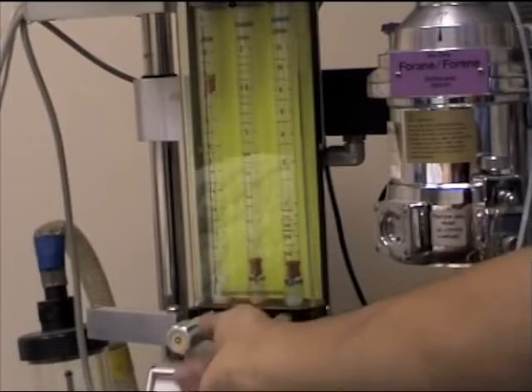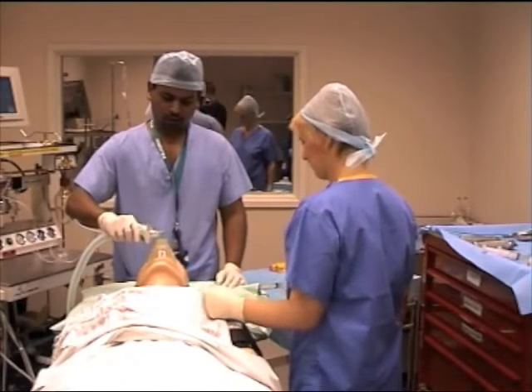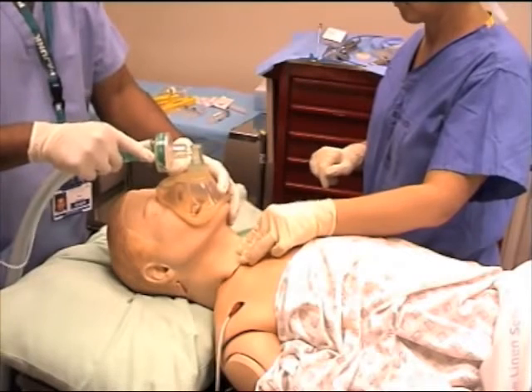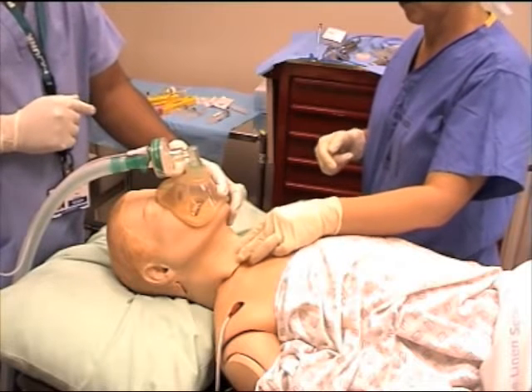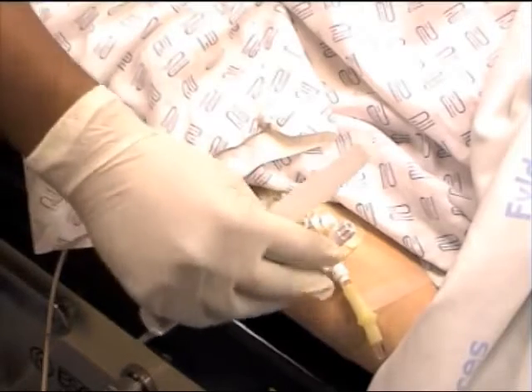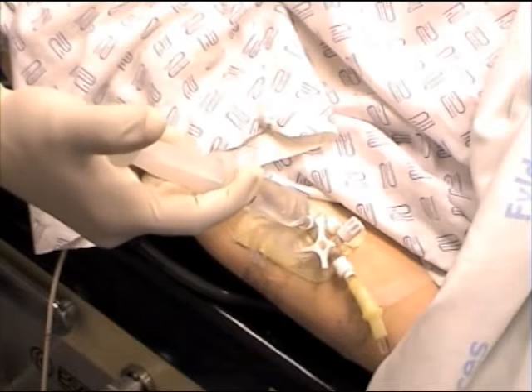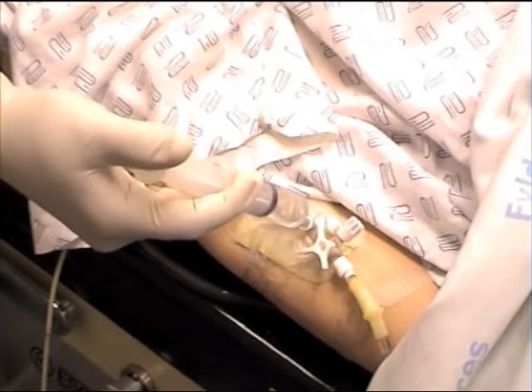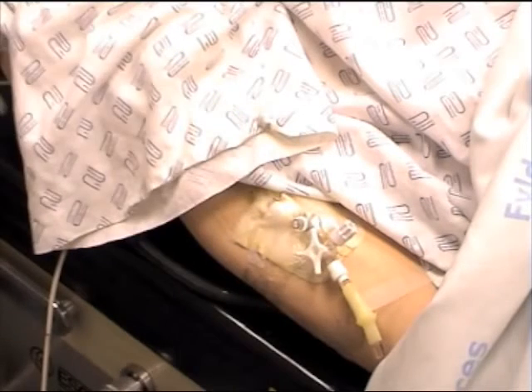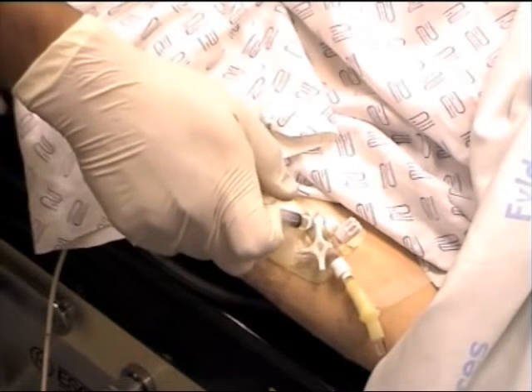Pre-oxygenation is done for 3 minutes or more with a tight-fitting face mask. Just before induction, cricoid is identified and a pressure of approximately 10 newtons is applied. Induction is commenced with a predetermined dose of either thiopentone or propofol, and this should be immediately followed by a muscle relaxant. Following succinylcholine, wait for 60 seconds before attempting intubation.